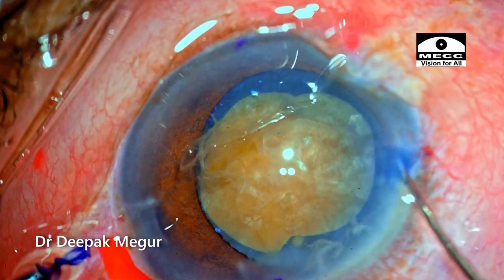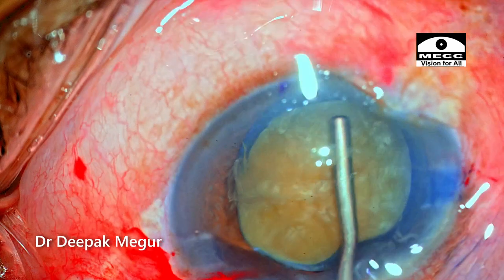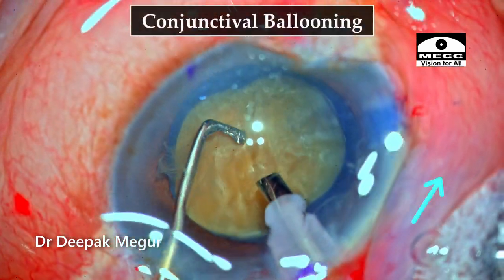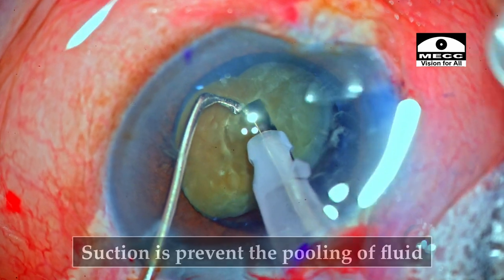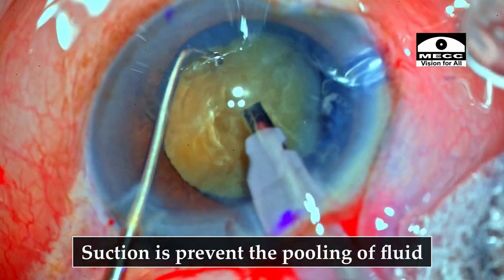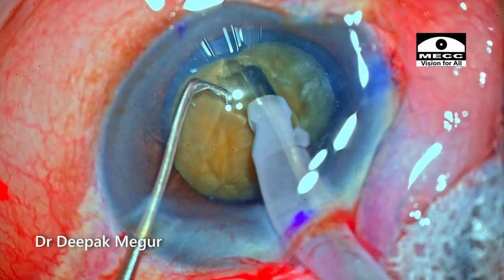Since this is going to be a free-floating nucleus and it is a hard nucleus, getting the chop right and dividing it is going to be a little bit challenging. The visualization is not great — the patient has deep-set eyes and there is some conjunctival ballooning, causing fluid to pool in. My assistant is using the suction pump to aspirate all the pooled fluid.